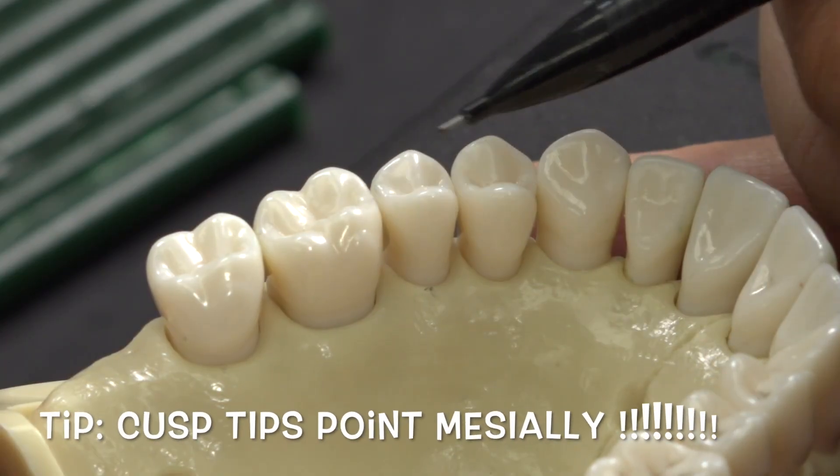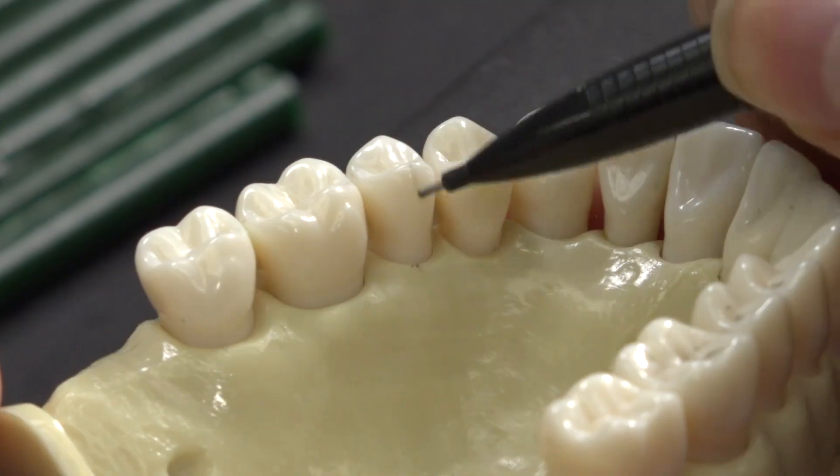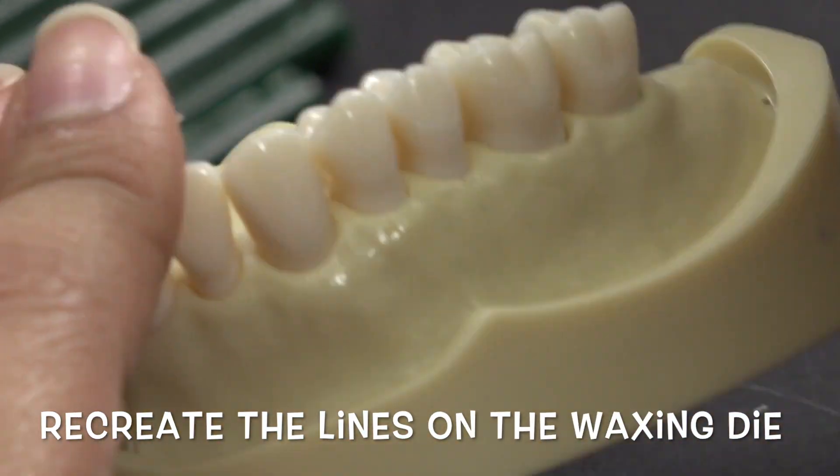Notice the cusp tips both flare towards the mesial. I like to mark the highest point of the cusp tip and bring the line down to the gums of the typodont to mark exactly where the cusp tips are. I also mark the points of contact on the adjacent teeth.